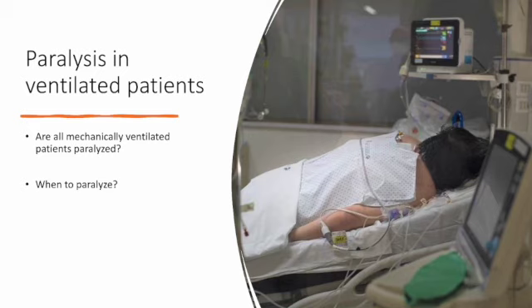Remember from earlier we talked about ARDS, and in ARDS we use a tidal volume of 4 to 6 cc's per kilogram rather than the typical 8 cc's per kilogram. And by decreasing the tidal volume, we decrease minute ventilation. In doing so, we increase CO2 retention, resulting in hypercapnia. And hypercapnia increases respiratory drive. So in these patients, despite using high levels of sedation, they'll usually be over-breathing the vent. This is an example of a time where a paralytic can be useful to prevent ventilator dysynchrony.